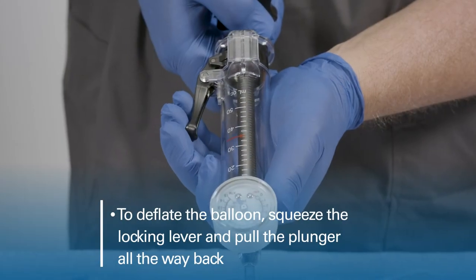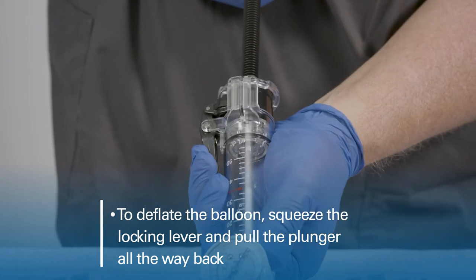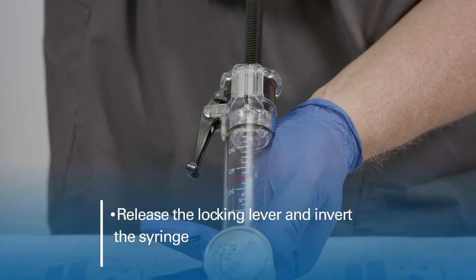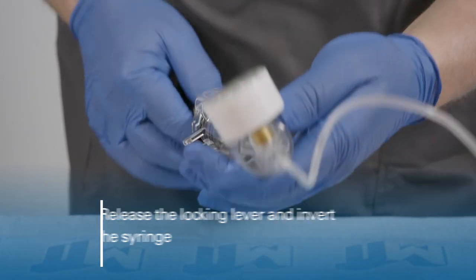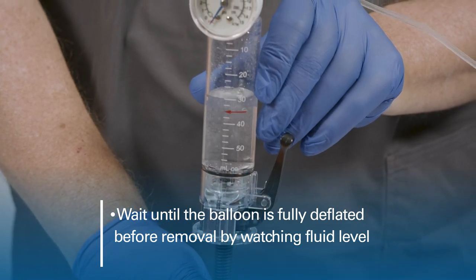To deflate the balloon, squeeze the locking lever and pull the plunger all the way back. Release the locking lever and invert the syringe. Wait until the balloon is fully deflated before removal by watching the fluid level.